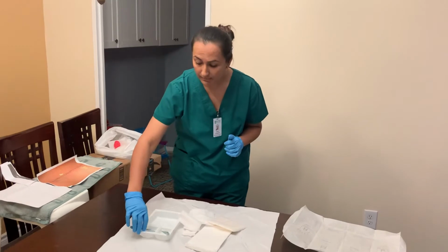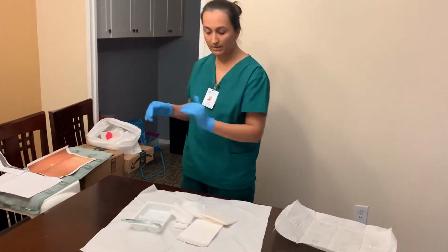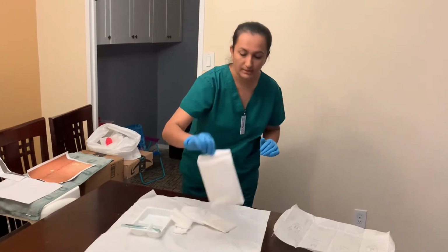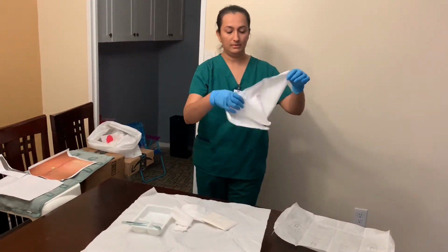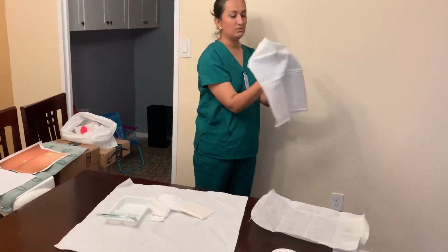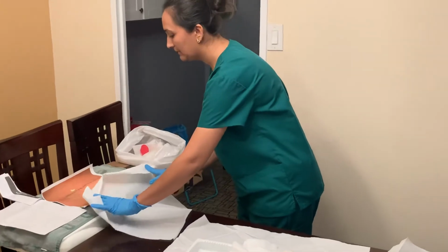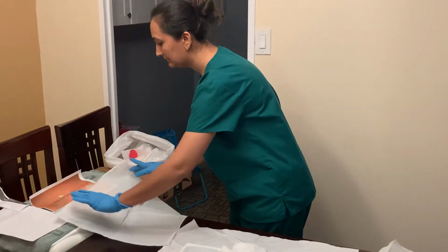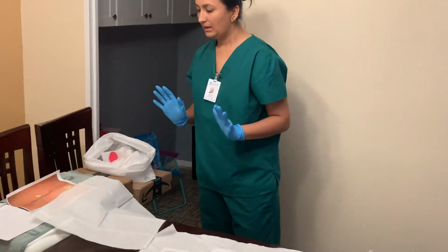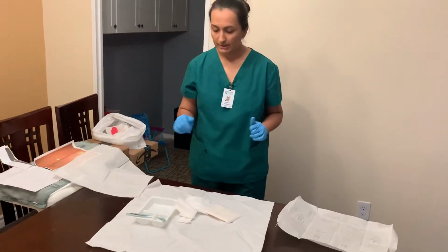Okay, sorry, I forgot one step here. Before we get started, I'm just going to put the drape. So here I have a drape, the pre-drape on the patient. Okay, perfect. So the drape is on, and now I will clean the wound.